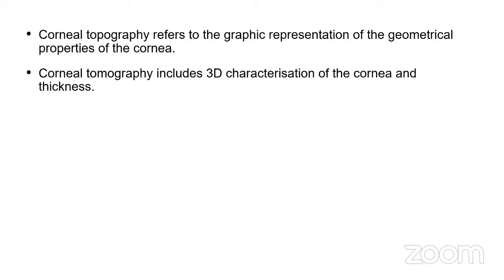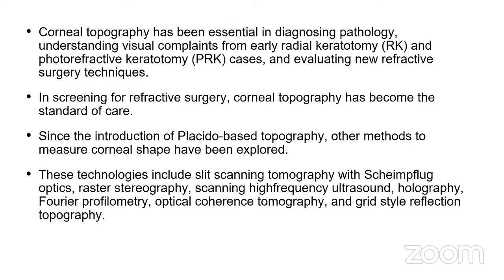The difference between topography and tomography. Corneal topography refers to the graphic representation of the geometrical properties of the cornea, while corneal tomography is the three-dimensional characterization of the cornea along with the thickness. So tomography is also known as topography plus pachymetry.